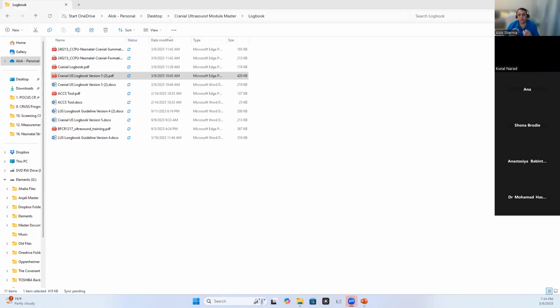I think the key question is why you're doing that scan. Why are you doing the mastoid view? Are you measuring the cerebellum? Are you looking for hemorrhage? So again, we'll talk about which probes might help when you have very small fontanelles. Any other questions?